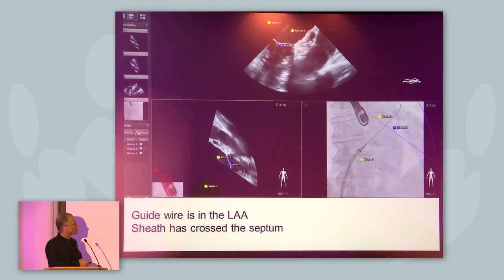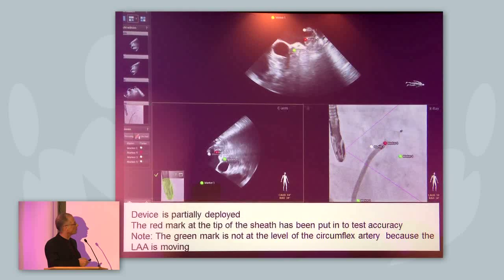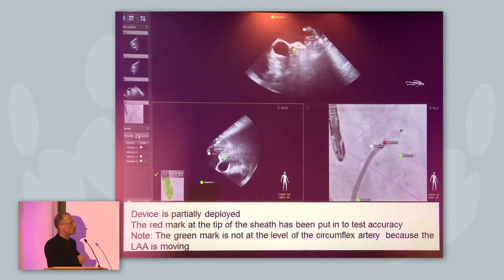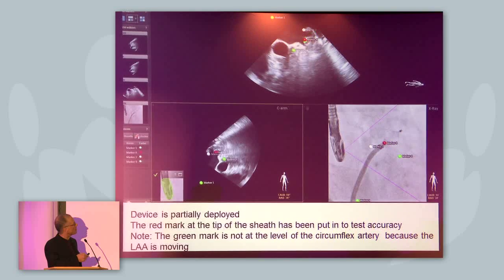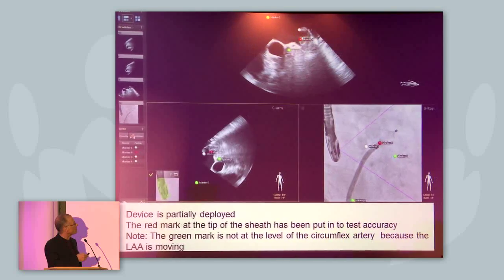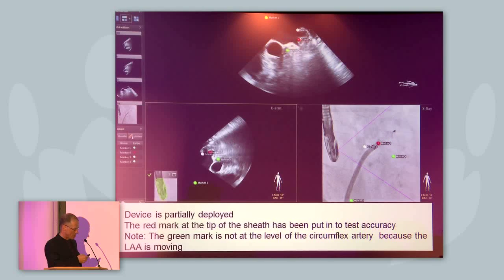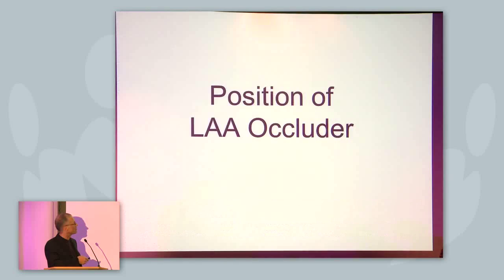The sheath is inserted again. We have these markers here and we know that we are still in a good position in the left atrial appendage. During device deployment, we have marked the pulmonary ridge and the circumflex. Because the patient is breathing and the heart is beating, you can see that these markers are not absolutely accurate — they may change depending upon systole, diastole, and breathing. We also made marks at the insertion of the delivery cable to the device just to check the accuracy of the system.